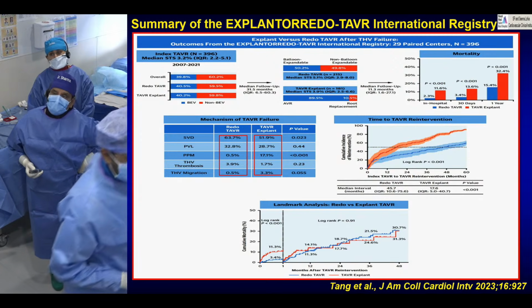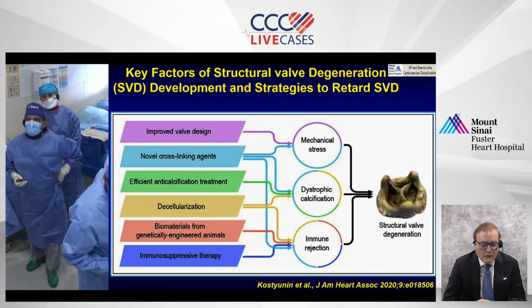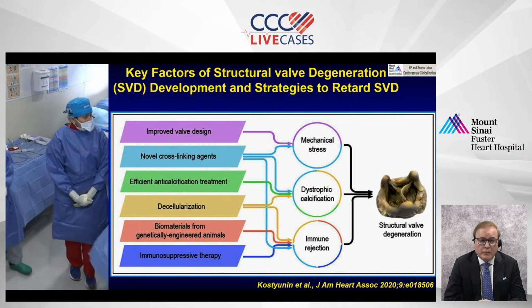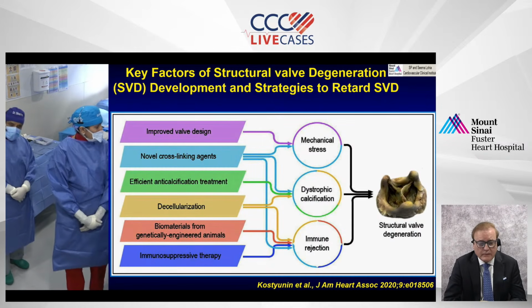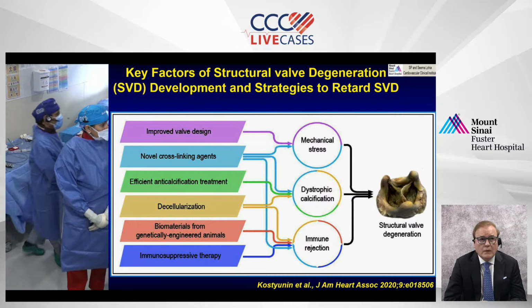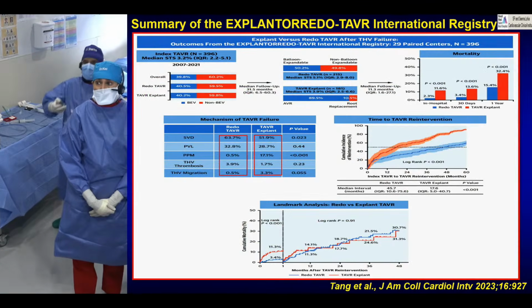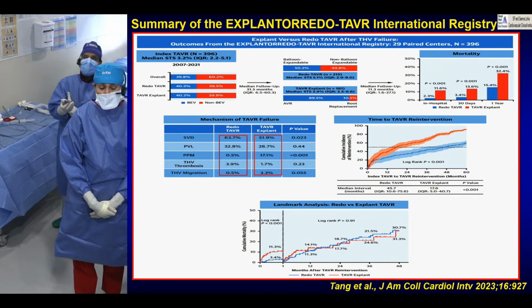Now, quick question for probably Sahil. Yeah. What was the AI index before and after? You can continue your presentation and Sahil can calculate that and come back. It looks like it was a 0.25 before and now 0.4. It's much better before, we can calculate it.